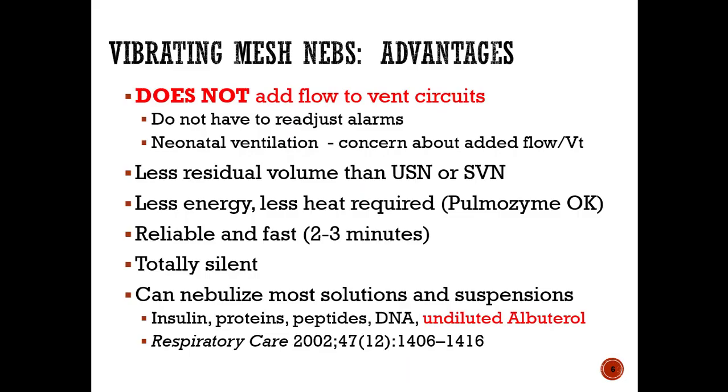So big advantages to the vibrating mesh nebs. Does not add flow to vent circuits. Really, really remember this. When you are trying to do a neb, and this is really particularly important in the NICU and peds, where the additional flow, because of how small your patient is, would actually change your ability to ventilate well. In adults, this is not so much an issue, but one of the huge advantages is that it does not add flow to the circuit.